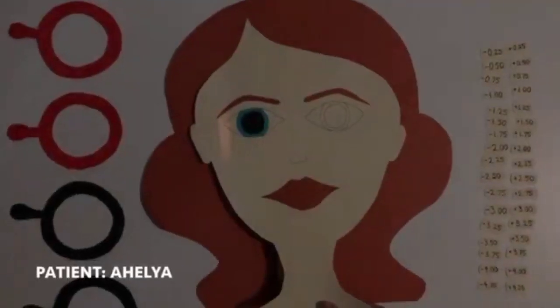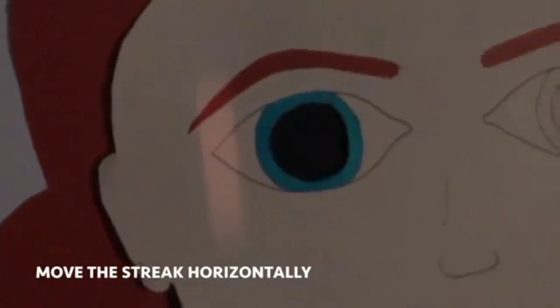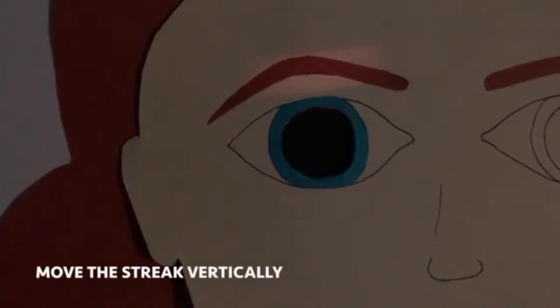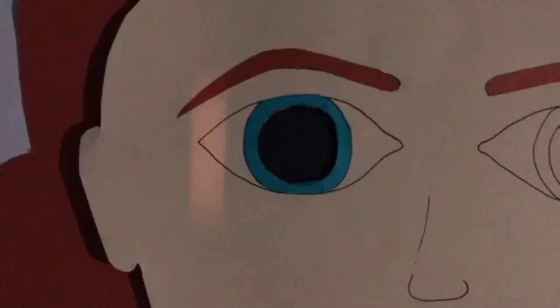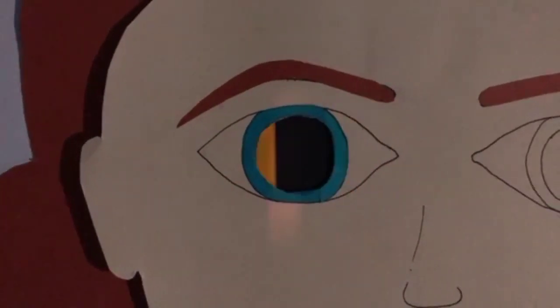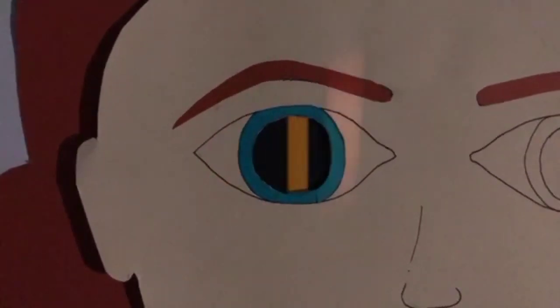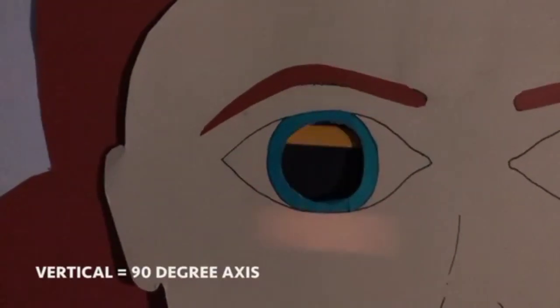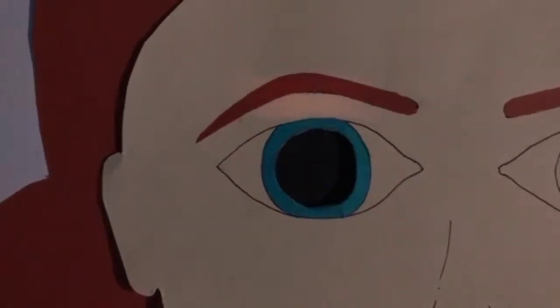This is our patient Ahelia. Move the streak horizontally and then move the streak vertically. The streak that is produced from the horizontal movement depicts the 180-degree axis, and the streak that is produced from the vertical movement depicts the 90-degree axis.